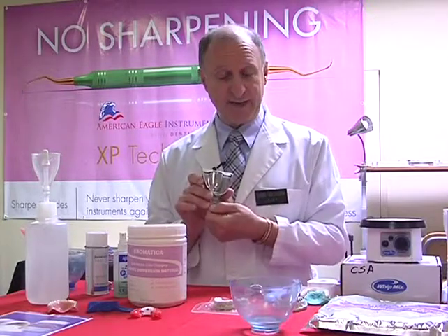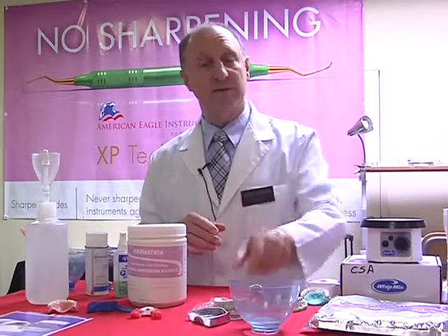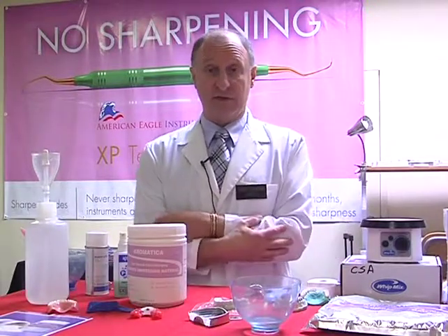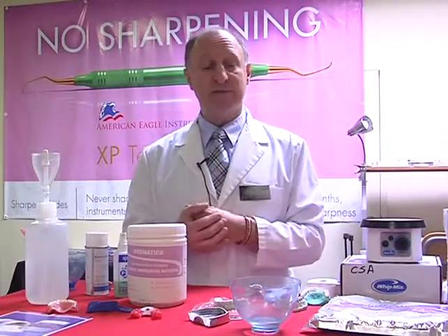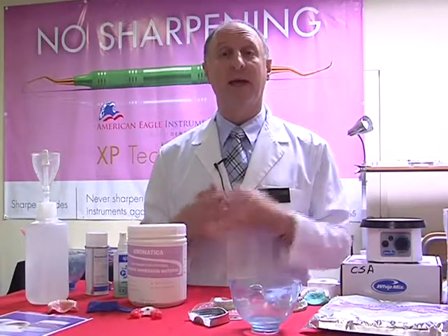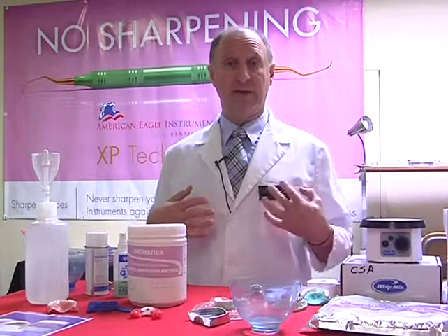So our tray is prepared. And this is what I would normally do. I have my patient who sat in the chair, and I'm going to relax them because they're very nervous to start with. The best way to relax them is give them a glass of room temperature water. It relaxes the patients. You can see them bodily relaxing.